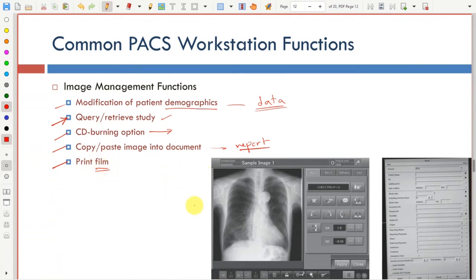Okay, so you will have an interface that will allow you to select, for example, if you want to send one image like this to the printer, or you can divide this area into, for example, 6 images. It depends on whatever you want to include for the doctor. So it has a lot of options that you can choose from.